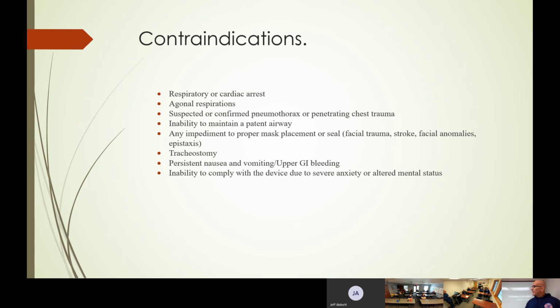Hey, Grammy, while we're on this, 15 is the age cutoff. Is it 15? It's 15. This is Tony Lounger's PowerPoint, but he has it as 18. So now we know, 15. That's good. Probably more size dependent than anything, for tidal volume. I'm glad that you told me that, because nobody's caught that in the past 2 days.